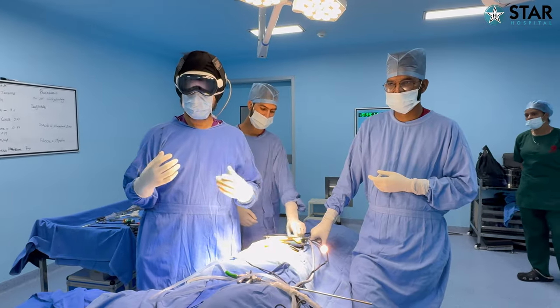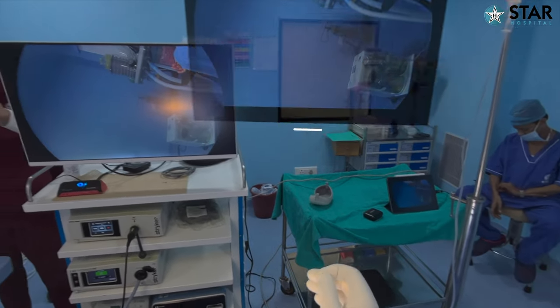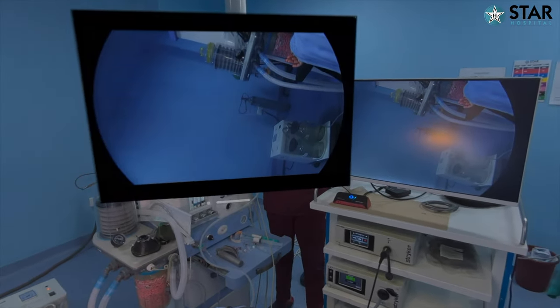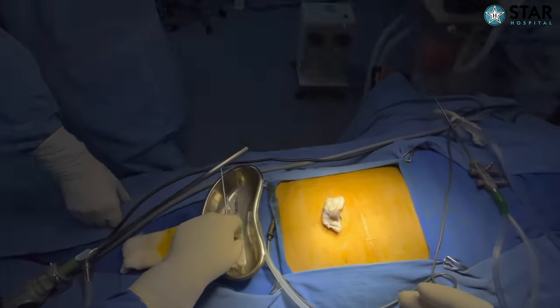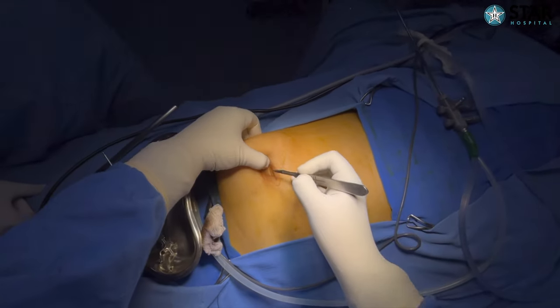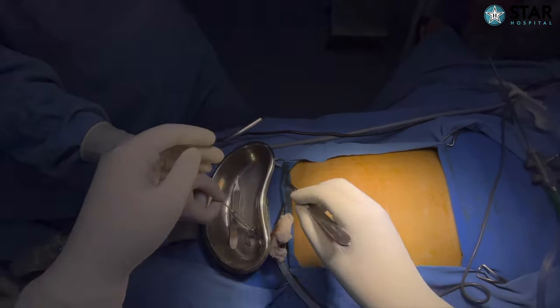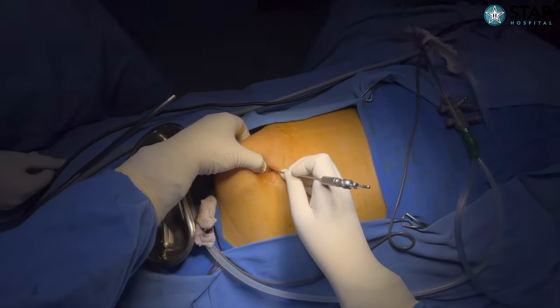I have put on this F1 vision probe and I have my own internal monitor, which I can place anywhere in the field that I want — right now it's right in front of me. The beauty is that we can see through it and do whatever we want without any hindrance from the vision probe, as the vision through it is quite clear.